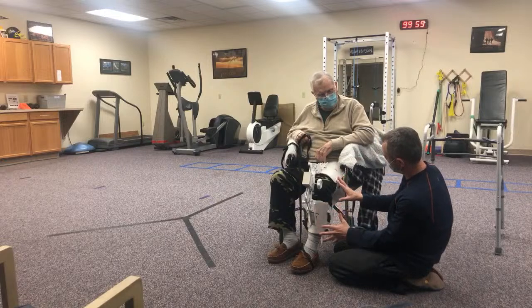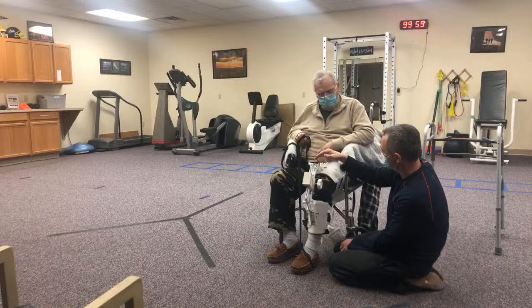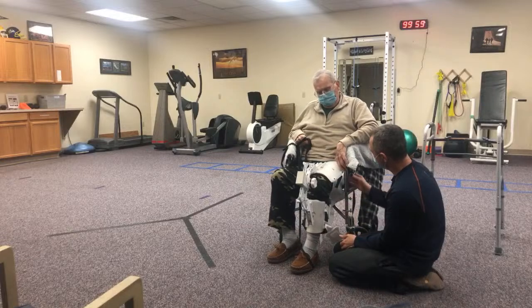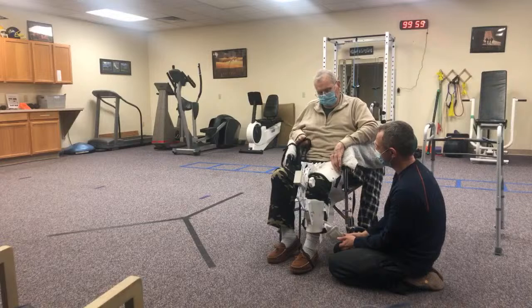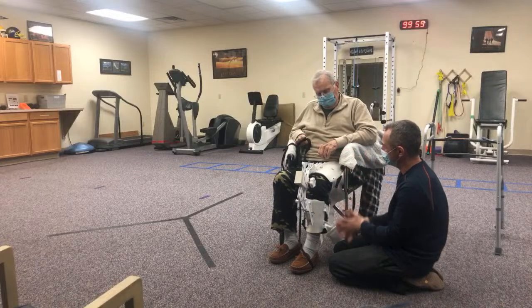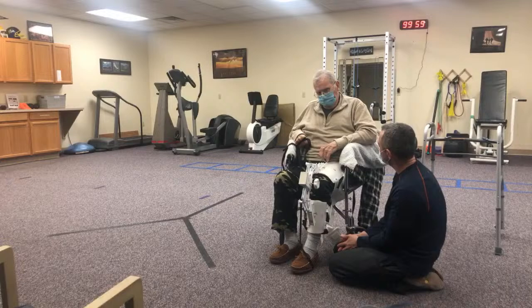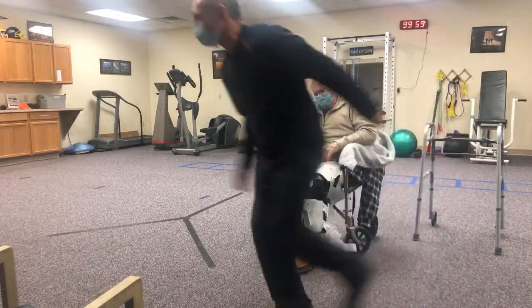I'm going to ask you to move your knee side to side, almost like you're bringing your knees together. Yeah, there you go. I'm more interested in going inward - like if you could kiss your knees together and relax, bring them together. That's it. What does that feel like? I can tolerate that - perfect.